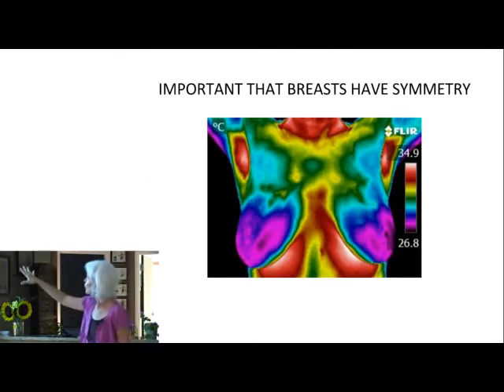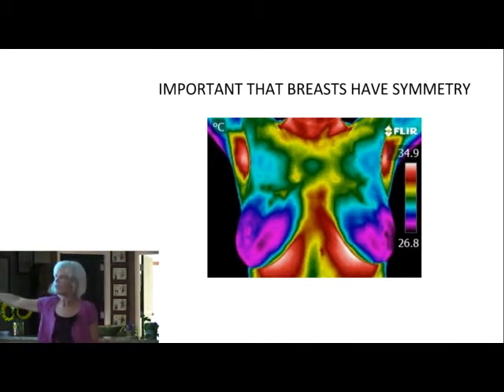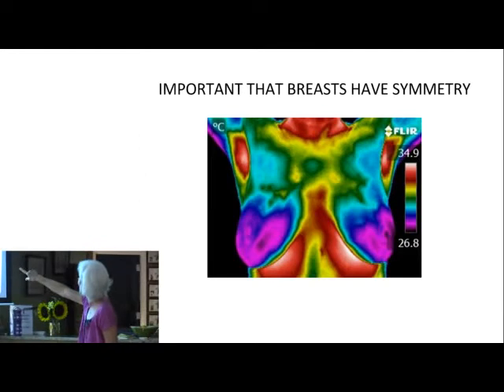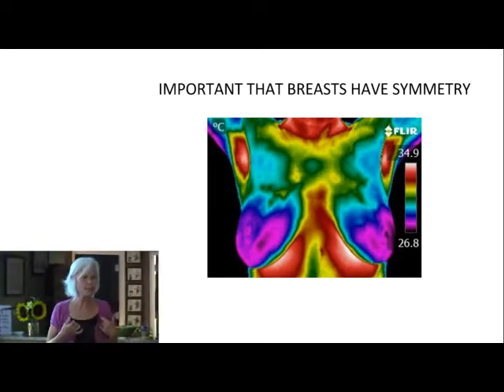This is an image in rainbow of a woman who has symmetry in her breast, and we look for symmetry. That's the sign of good breast health. Do you see how these colors are alike? So that always indicates good breast health because I don't see any areas in this image that I really have to measure. And I do these measurements.